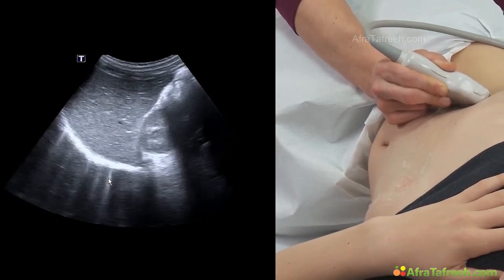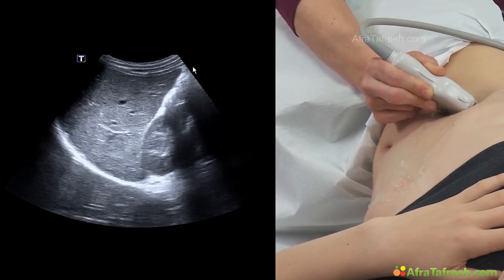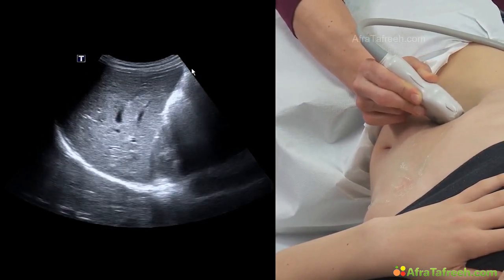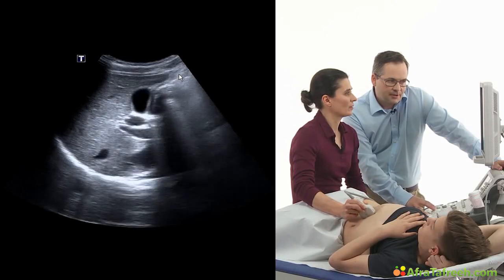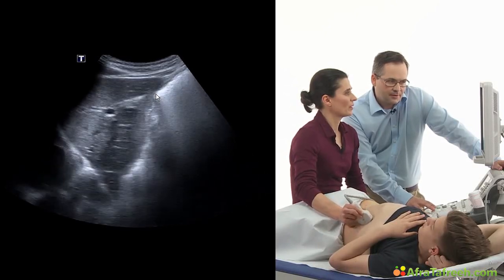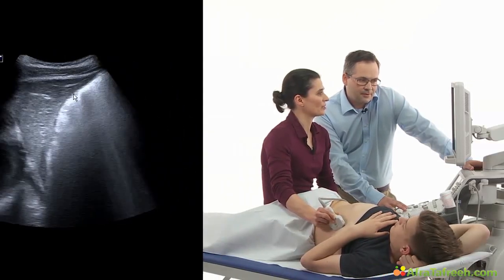And on my way back, I focus on the caudal rim of the liver. I have to apply some pressure to get good contact. Keep the caudal liver border in mind over here. I'm sweeping back until I come again back to the midline of the patient.